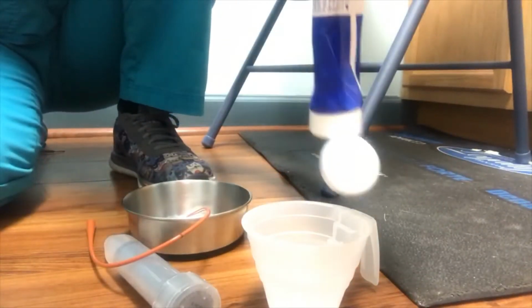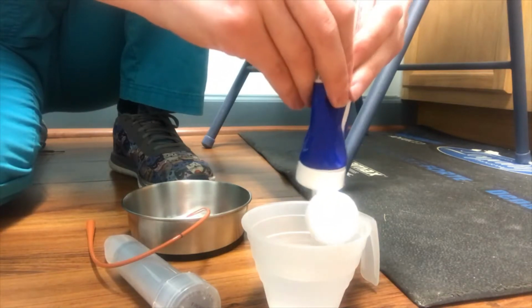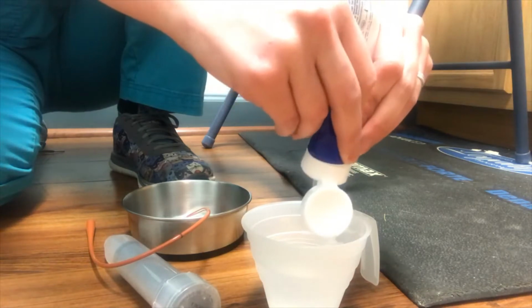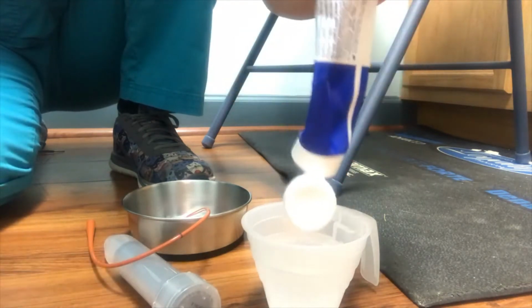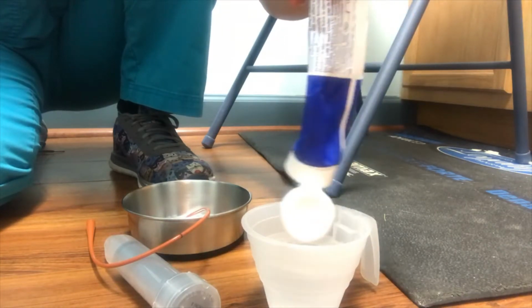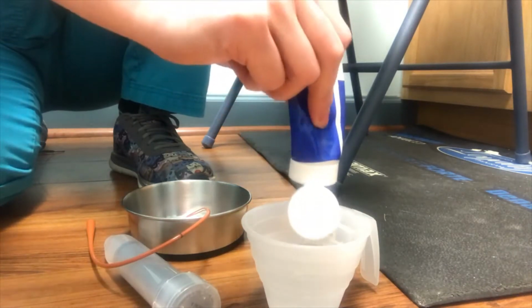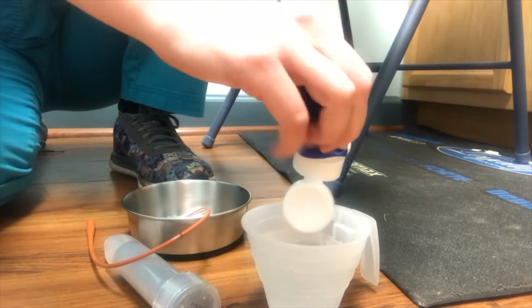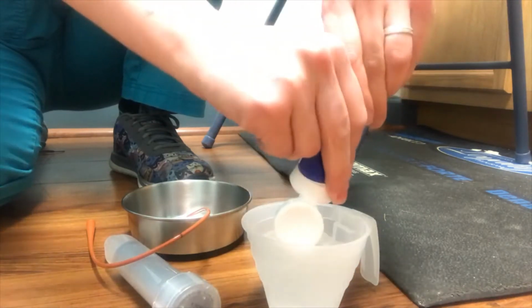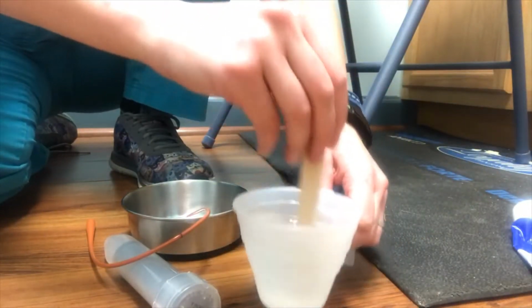I'll add the lube to my water here. It is important to note that for water temperature, you don't want the water temperature to be too far off your patient's temperature. If you have it too cold, it could potentially cause hypothermia. Or if it's too warm, you could cause hyperthermia. So you want to have it as close to the patient's internal body temperature as possible to help avoid that. So I have my mixture, and I'll just mix it up.